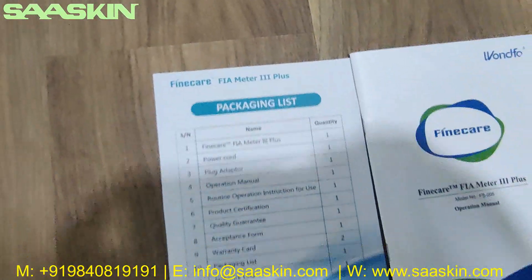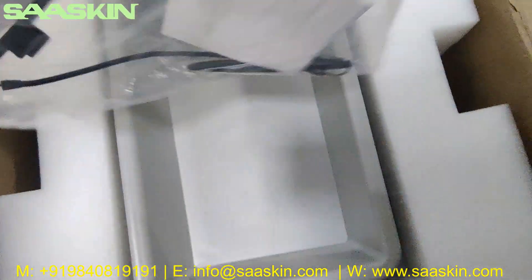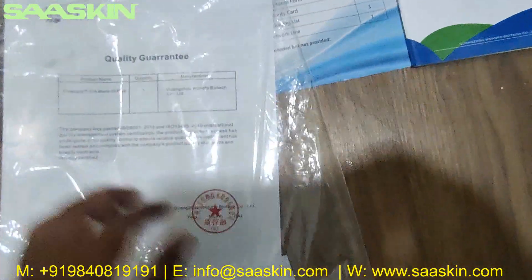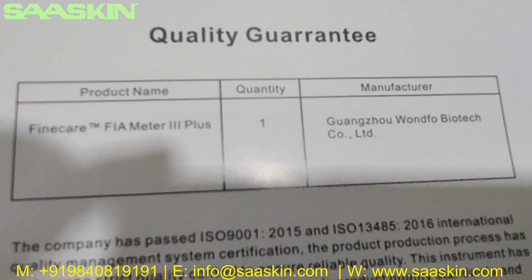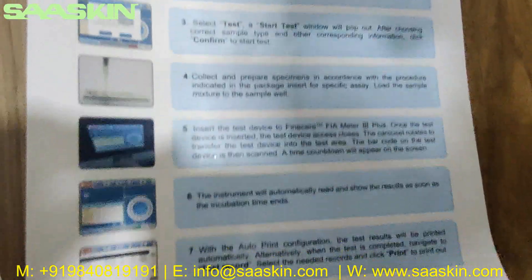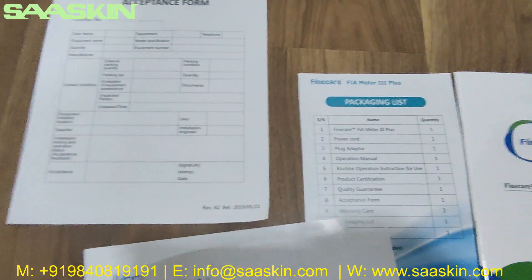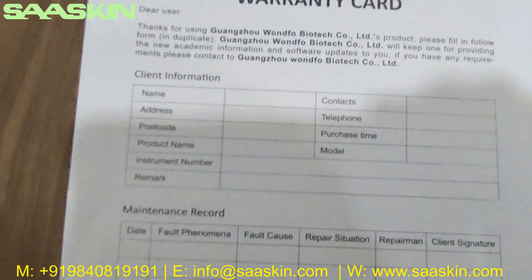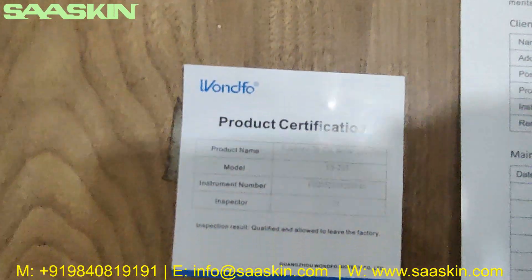Let me keep the packing list sheet aside. You have a set of documents here. You get a guarantee certificate — this is how it looks — for the Fine Care FIA Meter 3 Plus. There is a routine operation instruction for use, an instruction manual, an acceptance form, a warranty card, and a product certification.